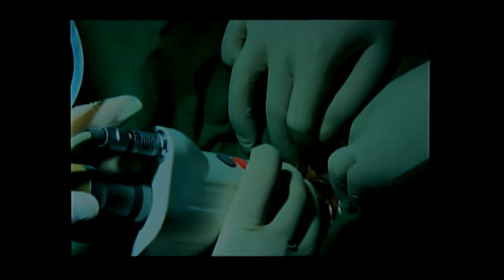And now, if you don't remember what to do, it says to you, insert the probe into the vagina and sink the length of the vagina, and then press set. So you don't have to remember. Okay, you do the procedure, I'll ask the questions afterward. So we advance the probe into the vagina until we reach the posterior fornix. And we press set.